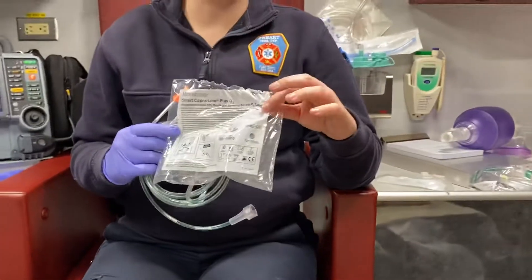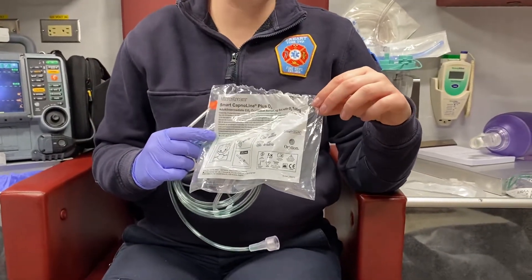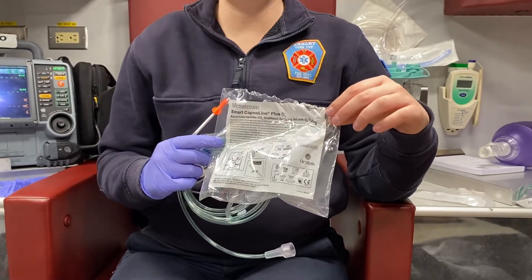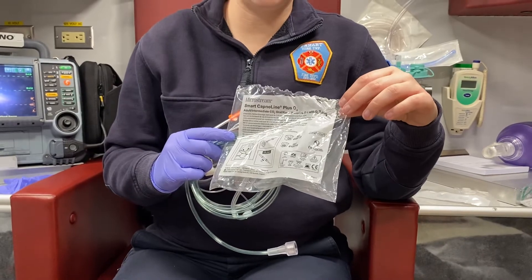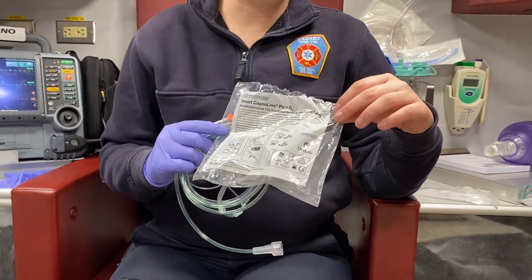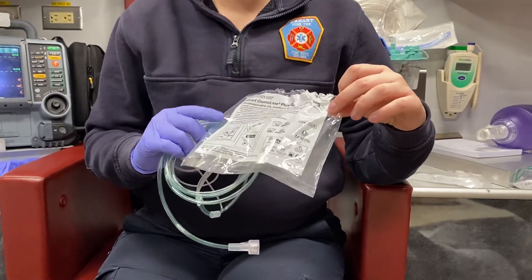Next we're going to talk about nasal cannulas. For nasal cannulas you're going to set your oxygen at one to six liters per minute. There are some infants that go on smaller amounts, but pre-hospital we typically only deal with the one to six. Some flow meters actually start at two to six liters per minute. This would be for a patient that doesn't need a high amount of oxygen but needs a little bit to get over that 94 percent. So this is the packaging.